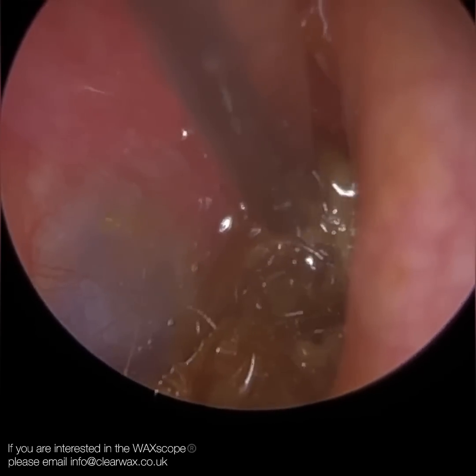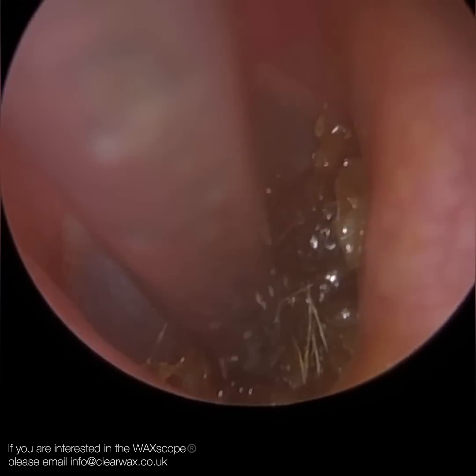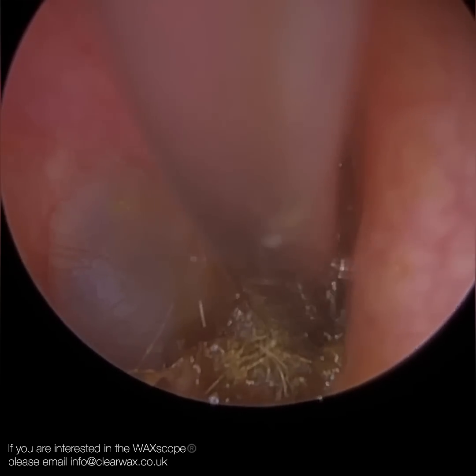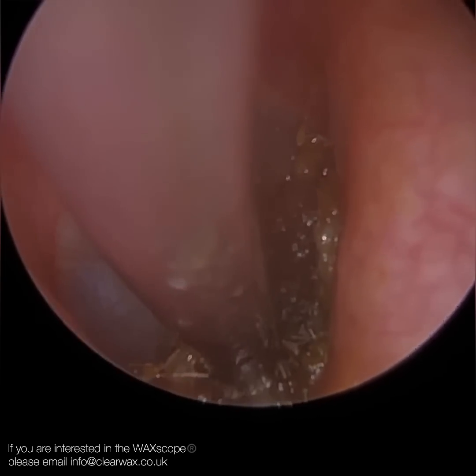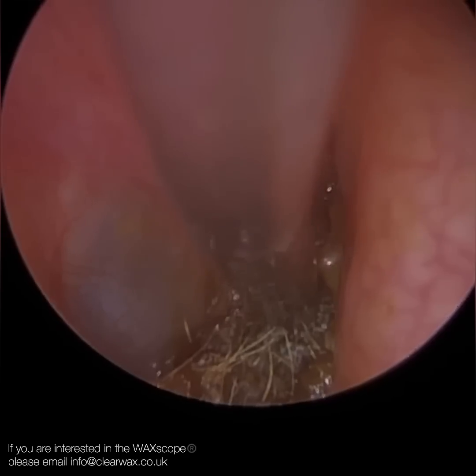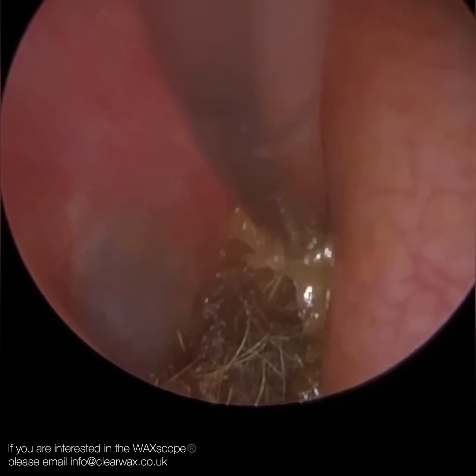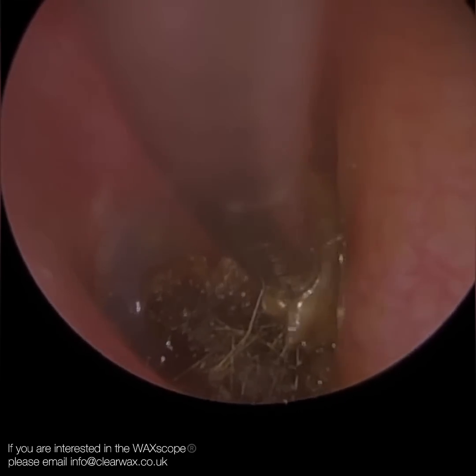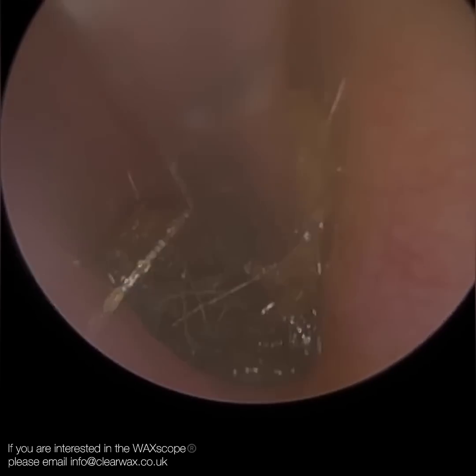We can position the endoscope on the back part of the ear canal and rotate it towards the anterior recess. We've got a full visual here. I've dosed this with a lot of olive oil because the wax is really stuck and sticky. I probably could have managed to get it out with the Waxscope, but at this stage it was better to move to the iClearScope for better optics. I'm lifting this — it's still a bit tricky, but you can lift it up and over. I've curled the end of the fine probe to avoid contact with the bone, as touching the bone would be very uncomfortable for the patient. I suspect that's what happened to this patient in the past — the specialists were making contact with the side walls. And there — she's freed it out.